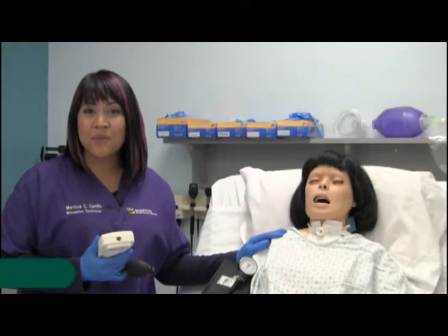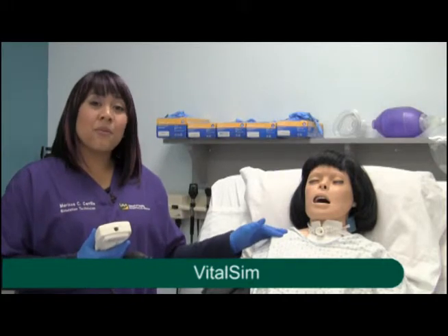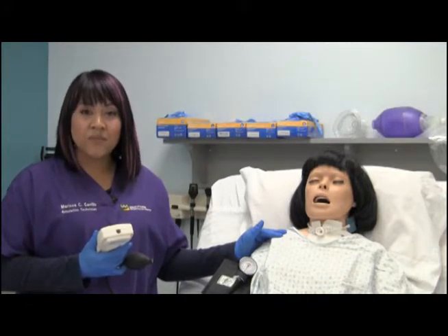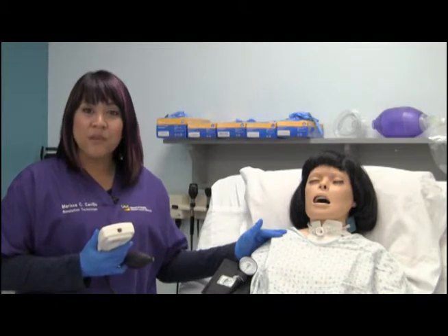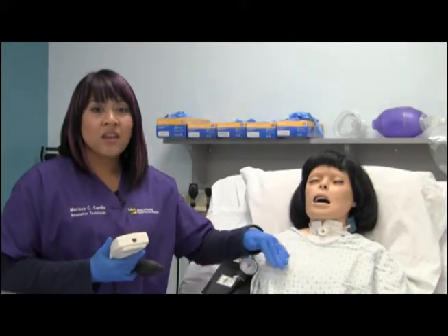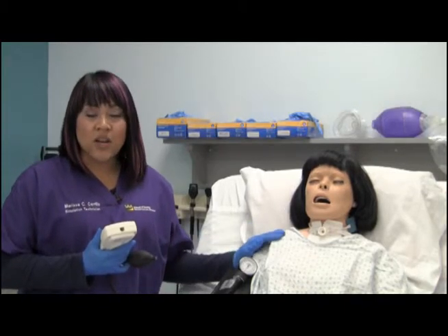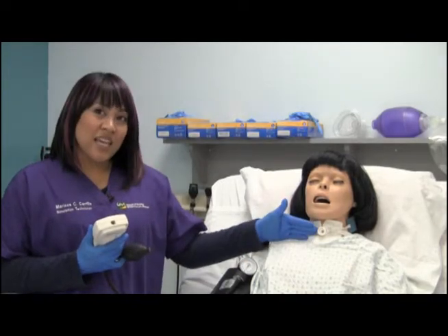Vital Sim mannequins, medium fidelity mannequins, are often used in simulation too. They are medium fidelity because they do not have as many realistic features as the SimBaby nor the SimMan 3G. Despite that, they are the most used because they still satisfy and meet many of your basic objectives. You may auscultate lung and heart and bowel sounds, monitor blood pressure, and perform skills like straight catheter insertion, nasogastric tube insertion, and tracheostomy care.